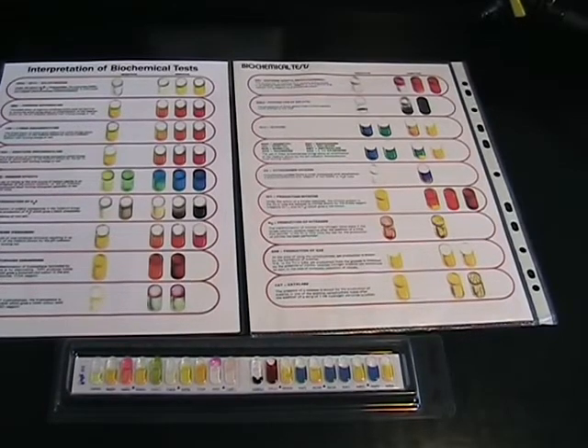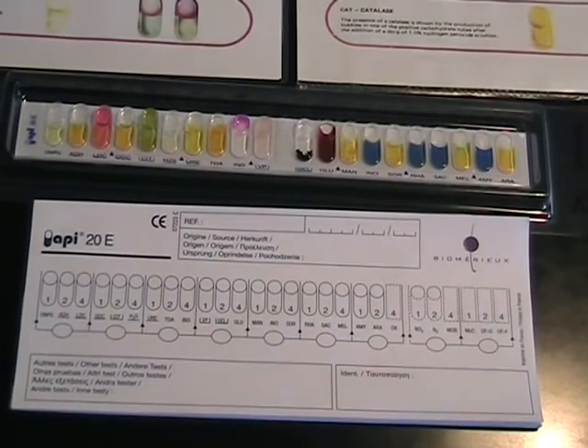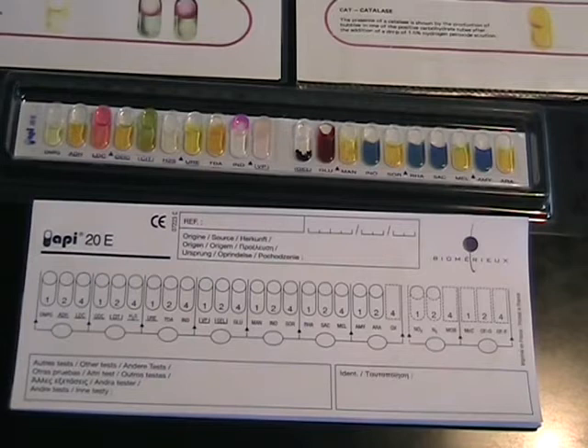Allow these tests to develop for a few minutes before reading the results. We've now developed our test strip and are ready to read the results. We use the chart above to determine what those results are. There must be some yellow colour in the sugar tests for them to be positive, and note the pink ring on the INDOL test. We're going to score the strip as a series of numbers on the paper strip provided, and then use these numbers to look up the organism in an API book.